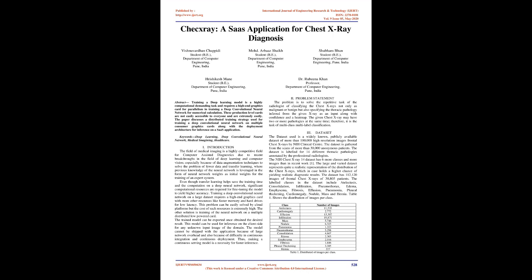Introduction. The field of medical imaging is a highly competitive field for computer-assisted diagnostics due to recent breakthroughs in the field of deep learning and computer vision, especially because of data augmentation techniques to solve the problem of fewer data, and transfer learning, where previous knowledge of the neural network is leveraged in the form of neural network weights as initial weights for the training of an expert system.